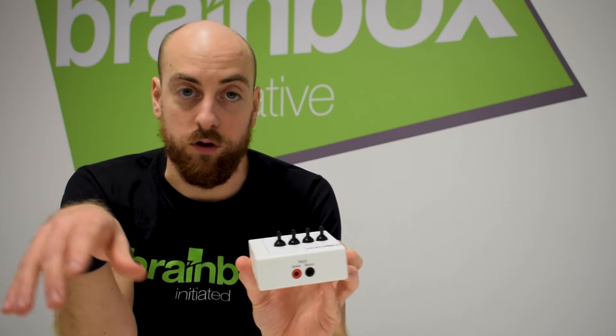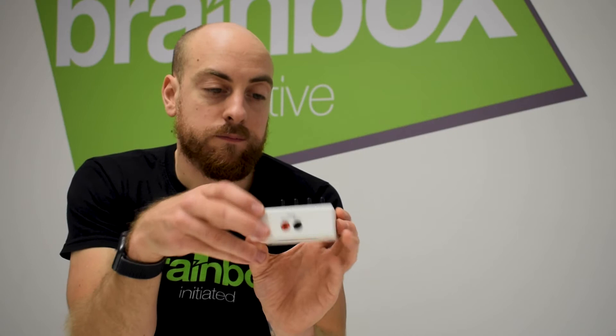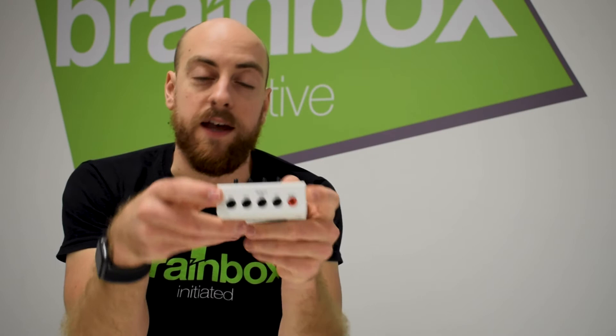Also in the box is the splitter module. We can use this to take our single-channel stimulating device and divide those up into HD montages. Each of these channels has a 10 kilohm resistor, which means we can do some fairly accurate impedance measuring as well. The two ports come from the stimulator and are then split into four ports on the other side.